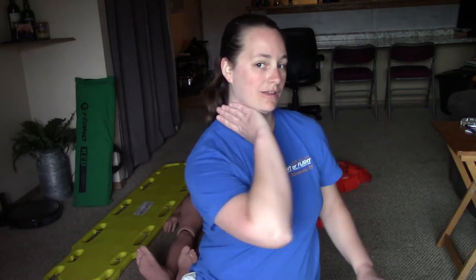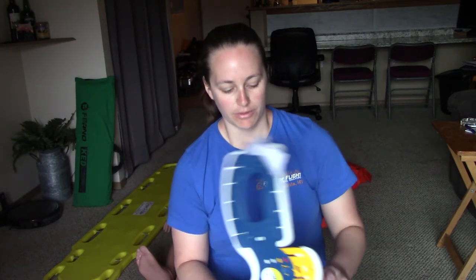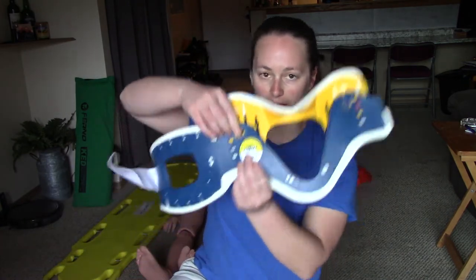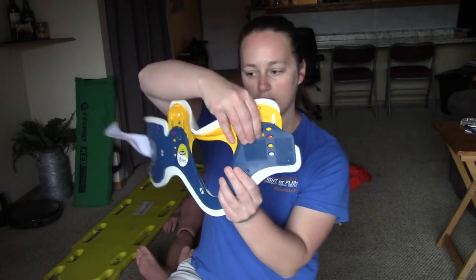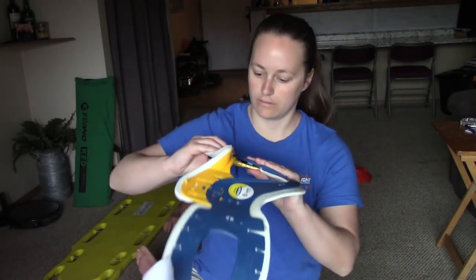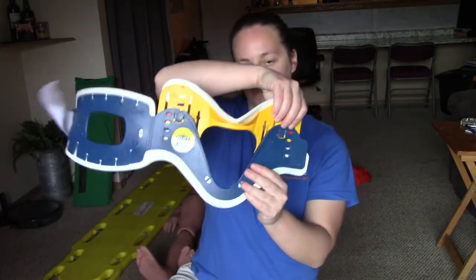The fingers-on-the-shoulder method doesn't work very well because most people seem to measure to a full four fingers regardless of whether they're short, regular, or tall. So after some experience in the field you'll probably just go by sight. Once you've determined the correct size, push the buttons back in to lock it in place — it's now snapped back and set on a certain height.